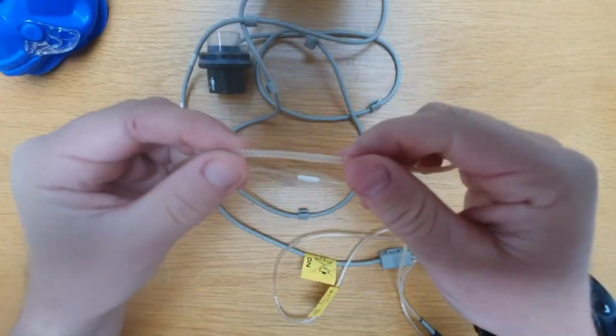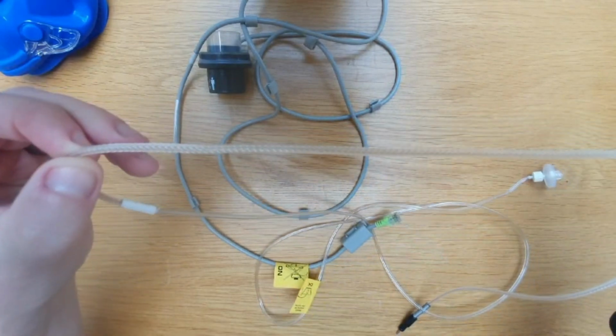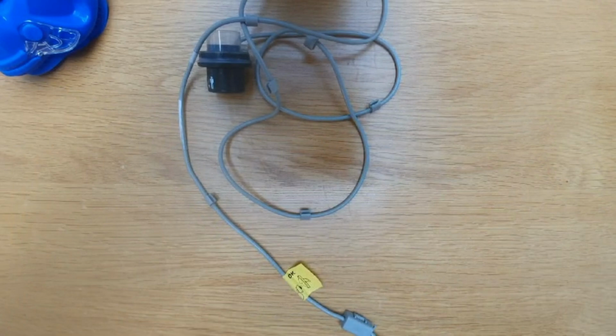A good way to know when the PermaPure needs replacing is when the rough part of this cable starts to discolor. This will no longer be translucent.